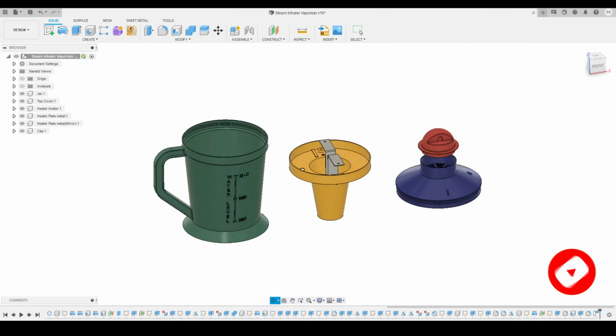Here you can see this is the profile we got, a closed profile. I will activate my revolve tool over here, and by default you can see the profile is selected. If it is not selected, there are some more things I want to correct. So I will go into the sketch and click on edit sketch, and here I have to connect this point to this line because I want this profile and these two profiles to be separate profiles.